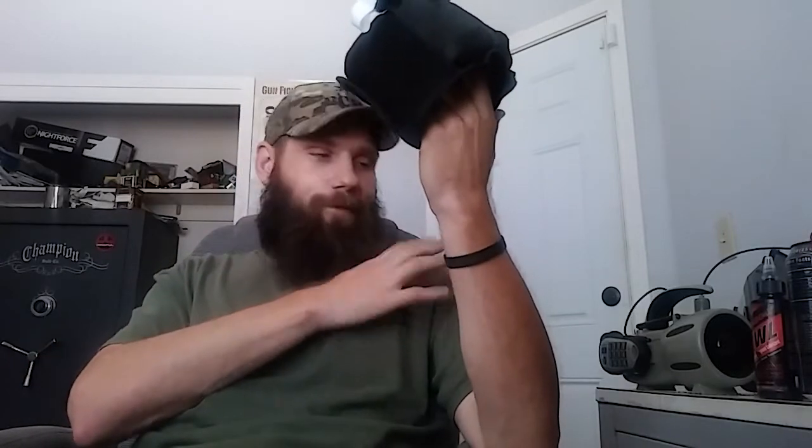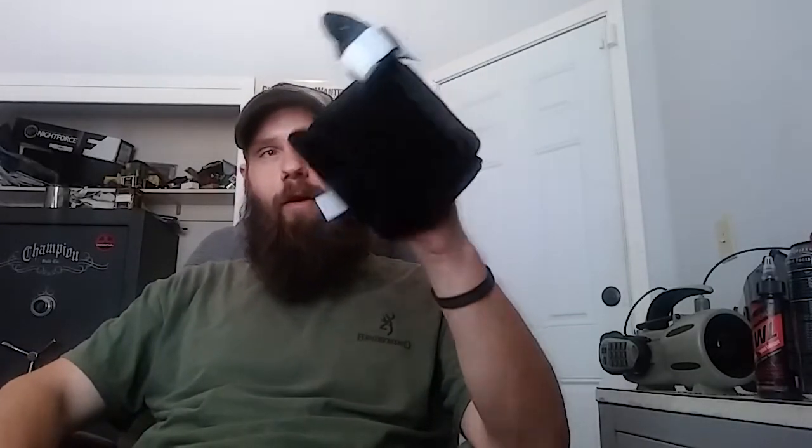And you never know, if you ever, God forbid, do get into a bad situation and you're leaking, the one thing that's going to save your life is keeping that blood in you till you can get medical care. So if you're actively bleeding badly, your time is very limited to stop that bleeding. It just depends on how bad you're bleeding. But if you get an artery bleed or something like that, and you can't apply enough pressure to stop it, it could be down to minutes that you have to get that stopped. So with these, at least you can tourniquet it off, stop the bleeding till you can get EMS there or someone else to take over.